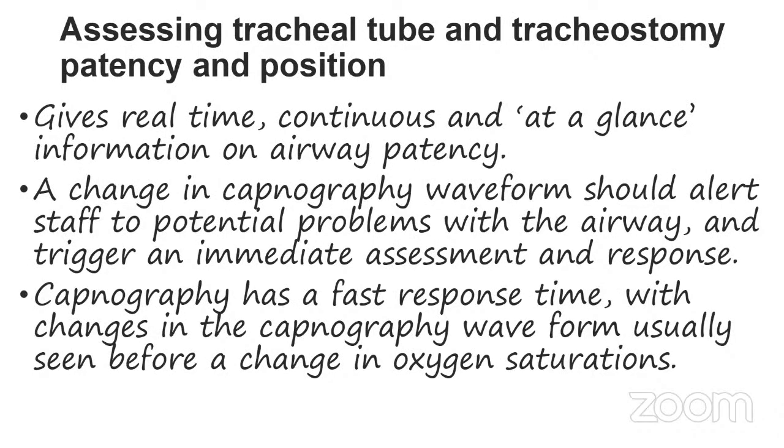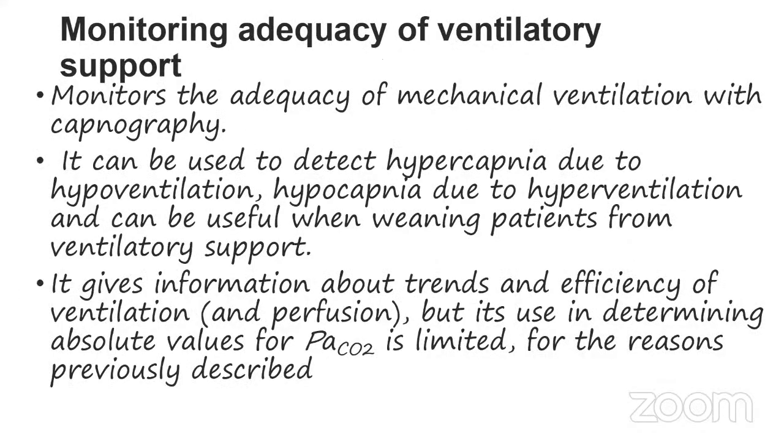It also helps to assess the tracheal tube and tracheostomy patency and position. It gives real-time, continuous, at-a-glance information about airway patency. A change in the capnography waveform should alert the staff to potential problems with the airway and trigger an immediate assessment and response. Capnography has a fast response time, with changes in the capnographic waveform usually seen before desaturation. ETCO2 monitoring also helps assess the adequacy of the ventilatory support.